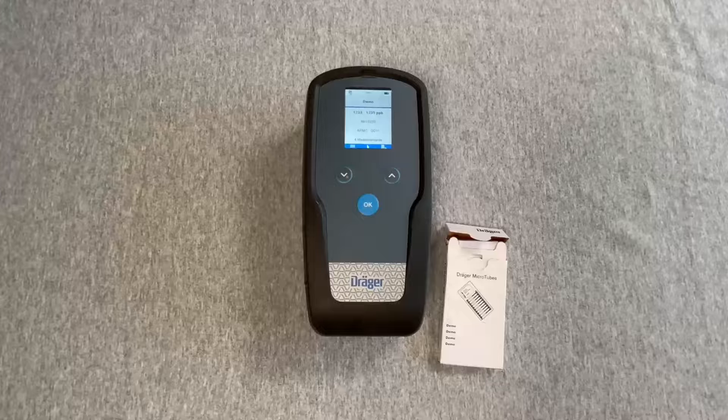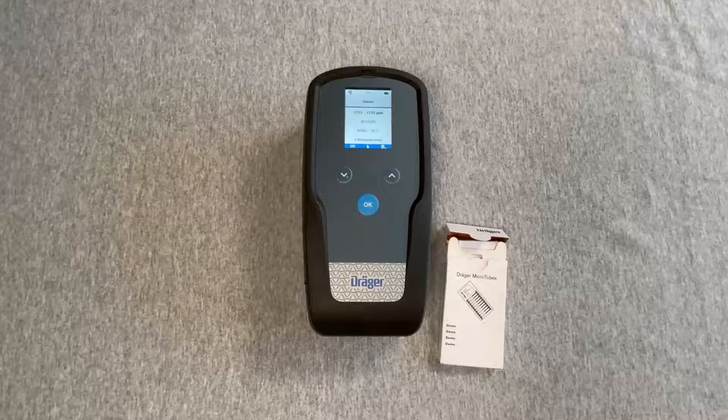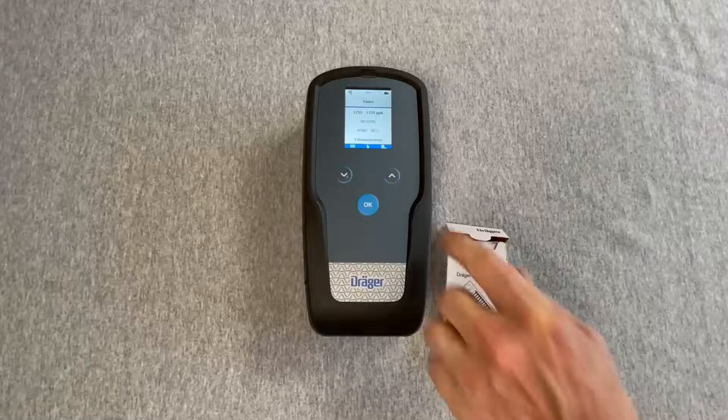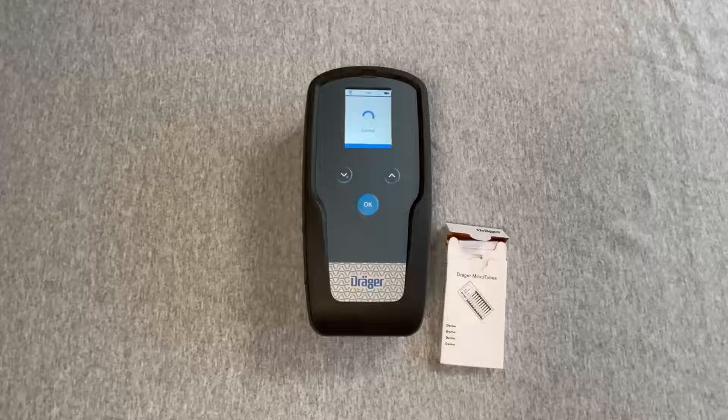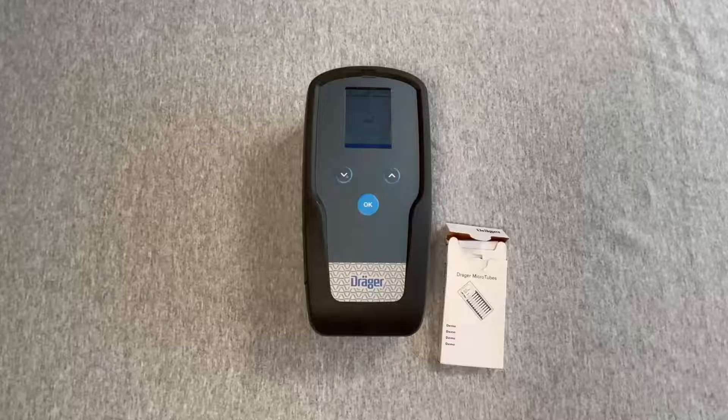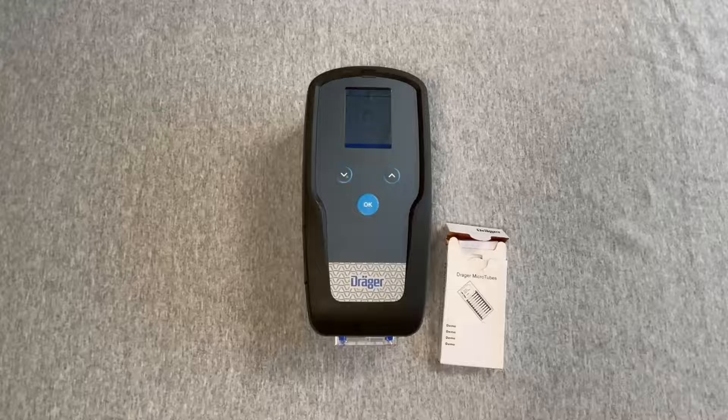Next, eject the microtube by pressing the up button. With the microtube check symbol in the blue bar, the display will show 'Ejecting.' Remove the microtube, then press and hold the OK button for a 3-2-1 countdown to shut the device off.